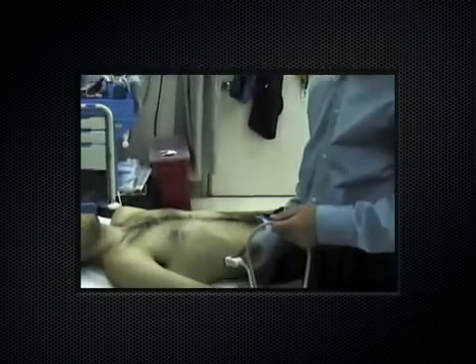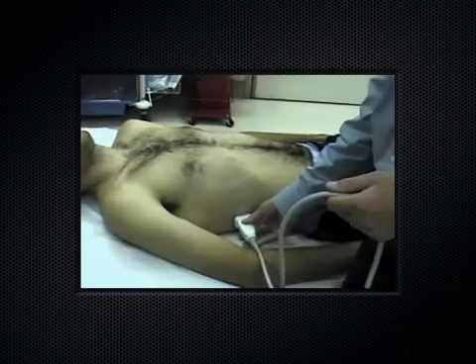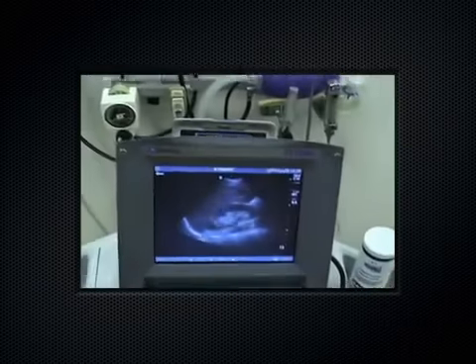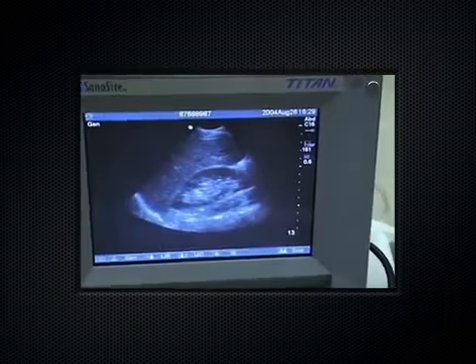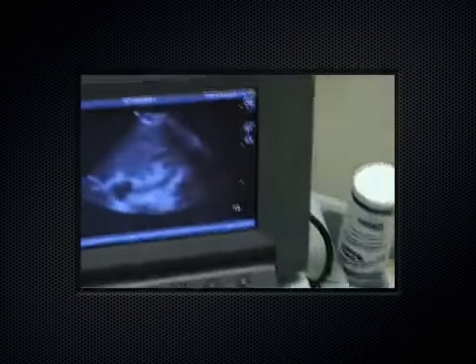Now, if we talk about the renal scan, you pretty much did one during the FAST exam, but you come over here and you get a nice coronal view of the kidney. You can actually get the kidney upper pole and lower pole on the screen at the same time in a long axis. And if you rotate the probe 90 degrees, you can get a short axis of the kidney. Rotate the probe towards the ceiling, you get a short axis of the kidney fanning through.